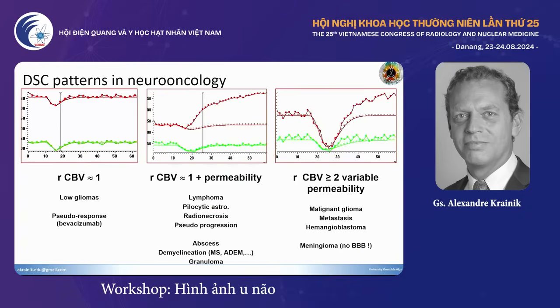Okay, then roughly you may have some lesions without increase of the cerebral blood volume, such as low-grade glioma, for instance.